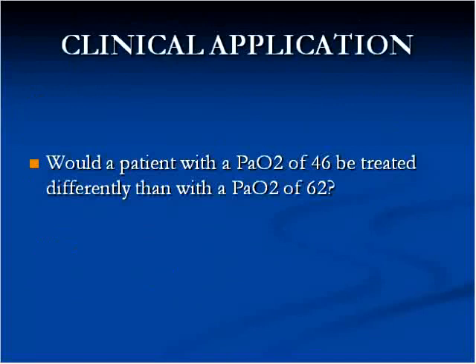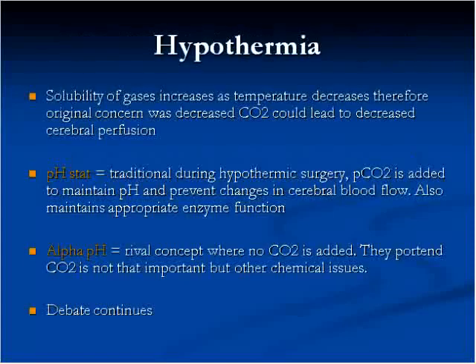Recommendations, again, standardized recommendations for temperature correction are, if you do indeed have a physician who wants to temperature correct your blood gases, you should also put the BTPS value next to it. So put the temperature-corrected value and then what it would have been at BTPS. This also helps in serial following of blood gases so that you know if indeed the PO2 is any different than the day before.